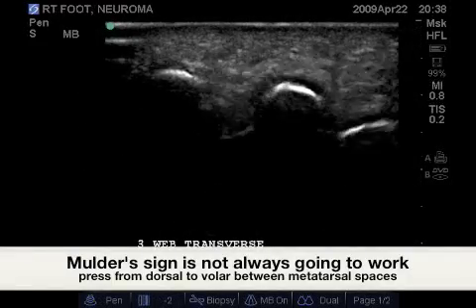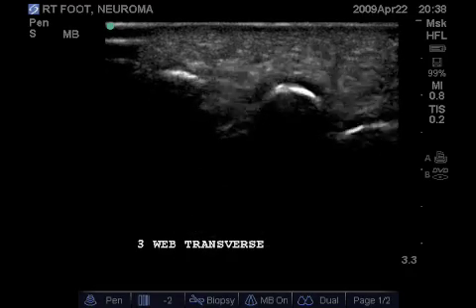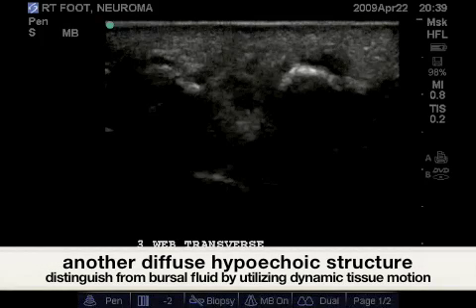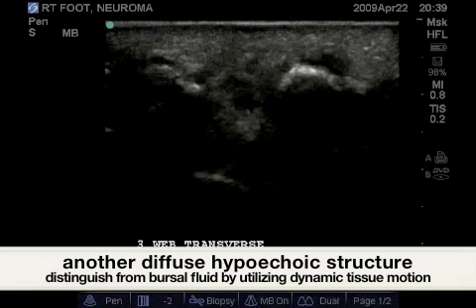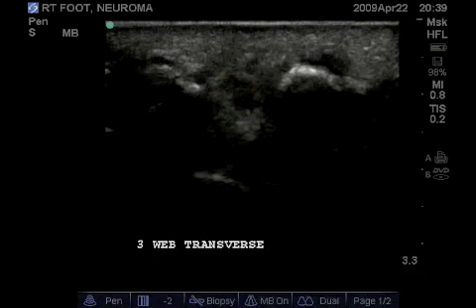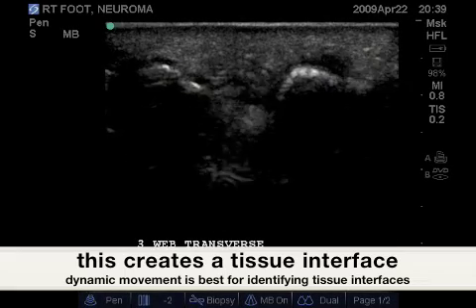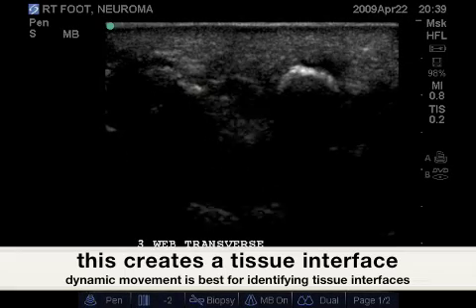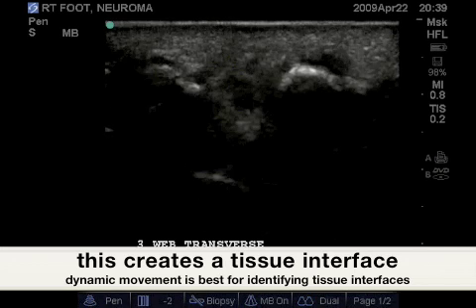Here's a less noticeable Morton's neuroma. Even when the Mulder's sign is applied, the difference in tissue interfaces is not clearly visible until force is applied from the dorsal aspect of the foot, with pressure downward towards the probe's surface on the plantar aspect. Forcing these tissues together creates a more noticeable tissue interface.